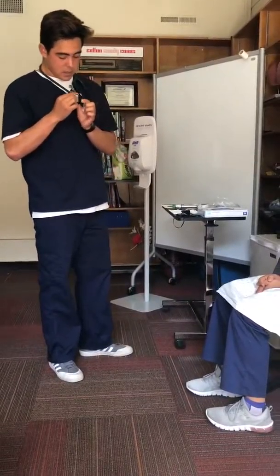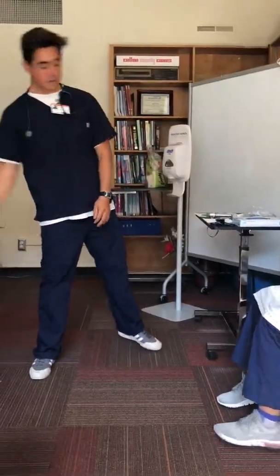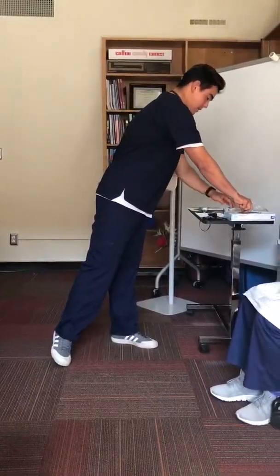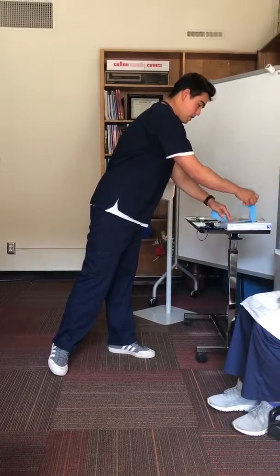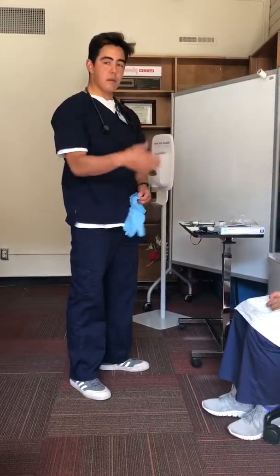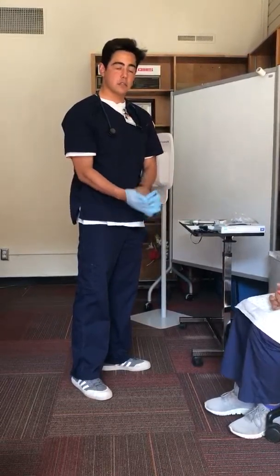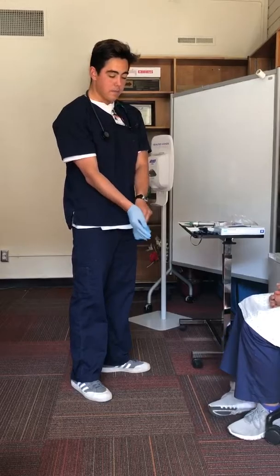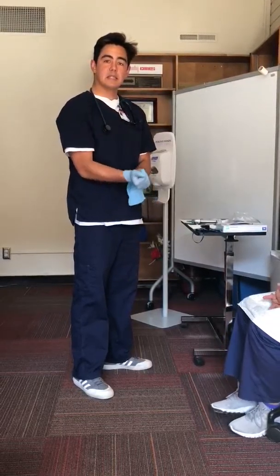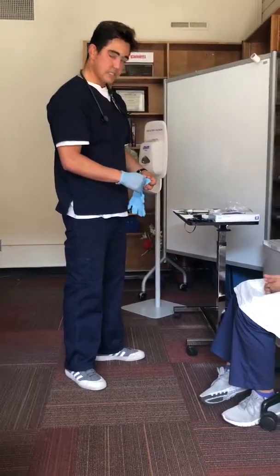Okay. So I'm disinfecting my stethoscope. Go ahead and dispose of that. And I'm going to apply my PPE. Okay, do you have any questions about this? No. Okay, if you had any family members in the room right now, we can go ahead and ask if they have any questions and confirm their understanding of the treatment as well. So we explain the procedure and we gain consent. We're going to go ahead and go into our assessment now.